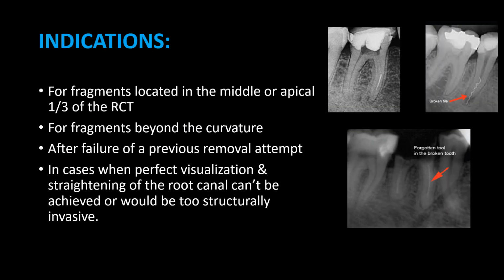Indications: for fragments located in the middle or apical 1/3 of the root canal. For fragments beyond the curvature. After failure of a previous removal attempt. In cases when perfect visualization and straightening of the root canal can't be achieved or would be too structurally invasive.